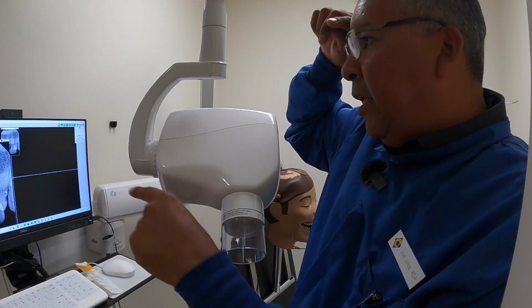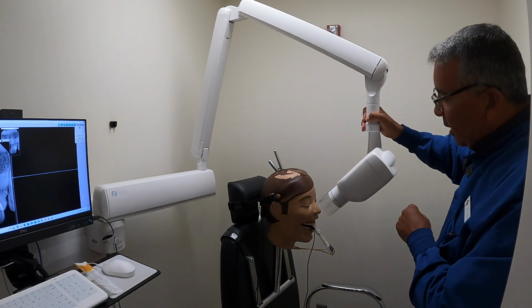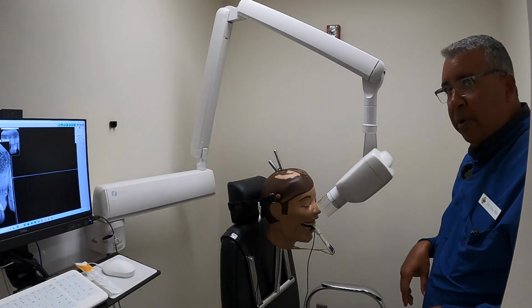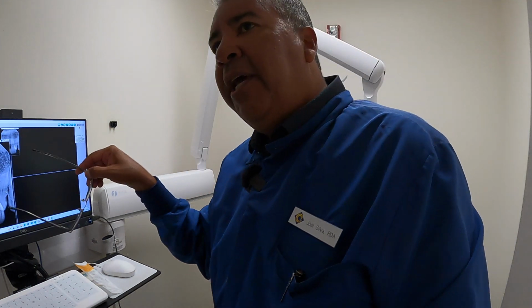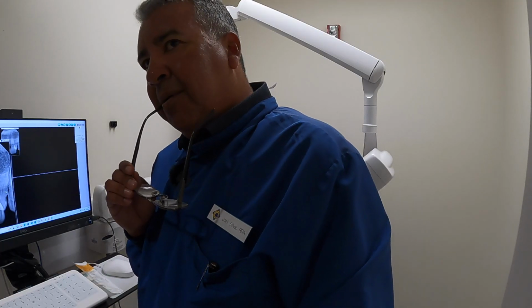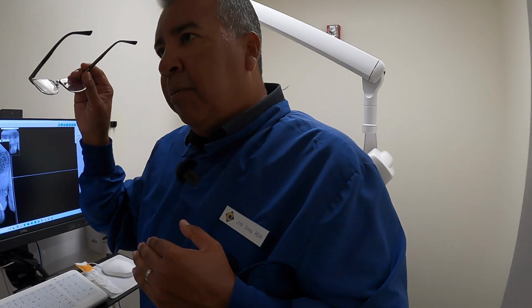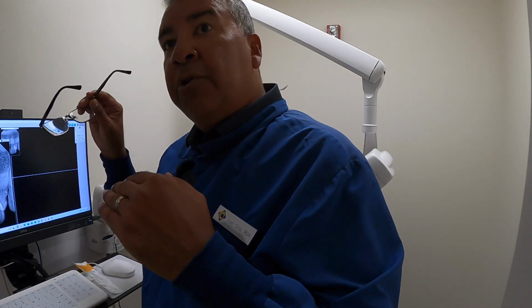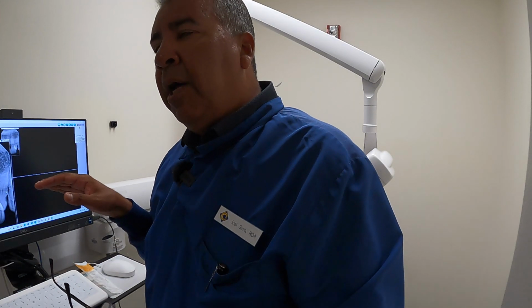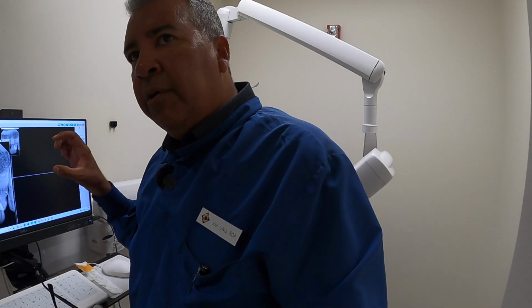Now I'm going to go back here and I'm going to do this and take it again. Now, if I'm going more positive, how is that going to change this, do you think? What is it going to look like now? I will show more of the tooth. I will make that tooth a little bit shorter. I will show more apex. I would much rather, if you're going to make any error at all, I would much rather you make it in the area of showing a little bit more tooth, if we have to do it.